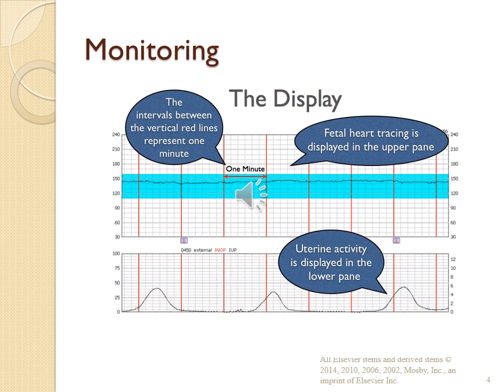External monitoring can be used in both antepartal and intrapartal periods. It does not require the membranes to be ruptured. The Toco transducer cannot assess the intensity of the contraction, which is the size of the peak that you see on the screen.